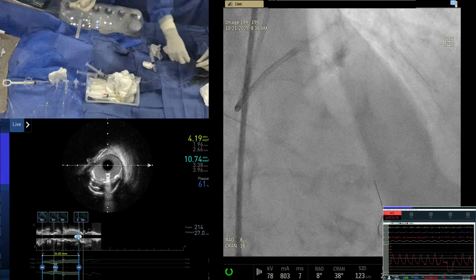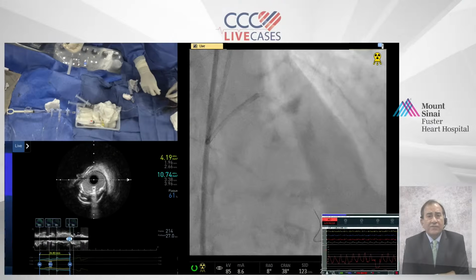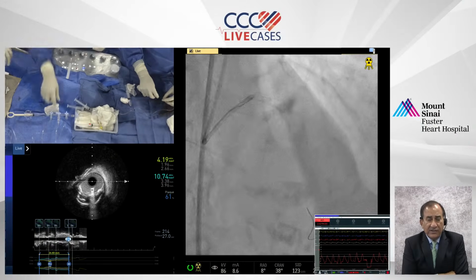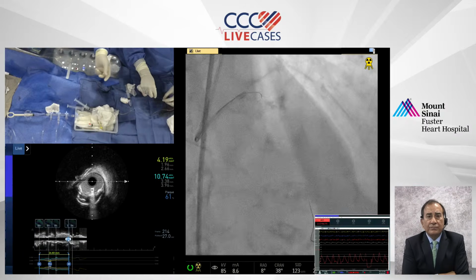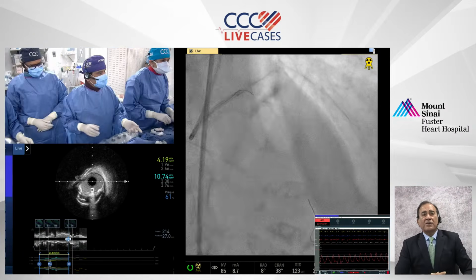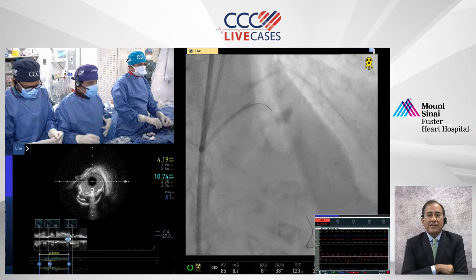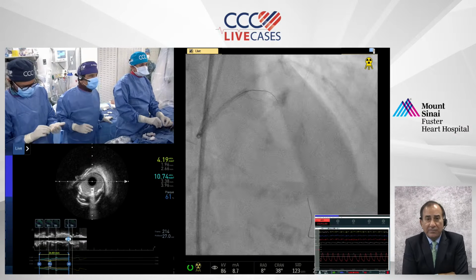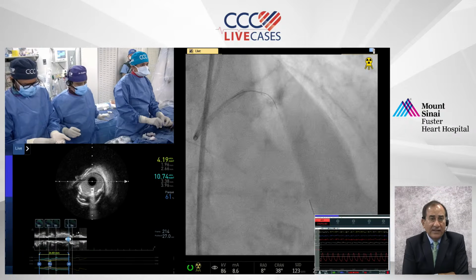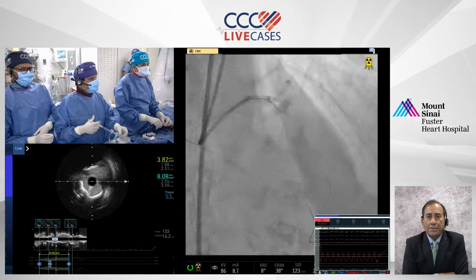There's another more important question here for you. What percentage of your rotablation is a single burr? I would say 95%. Such a remarkable statistic for our viewers. So many people kept asking about the number of burrs and the size. So there is the answer, and almost all of them would be 1.5, no? Yeah, most of them.